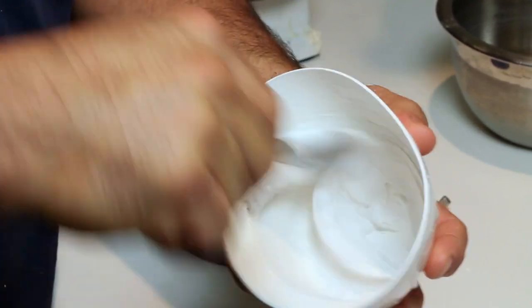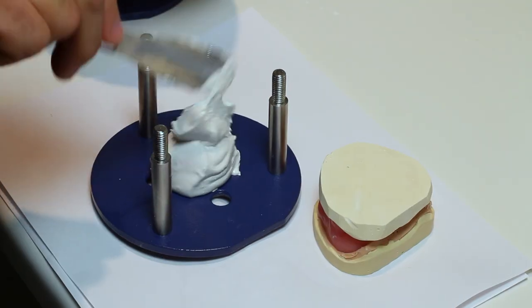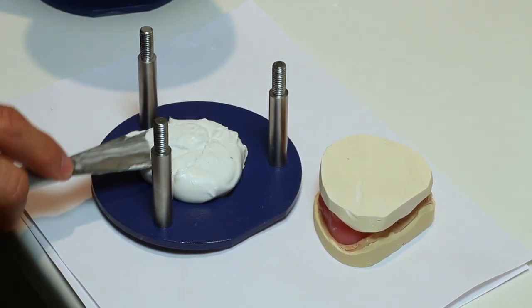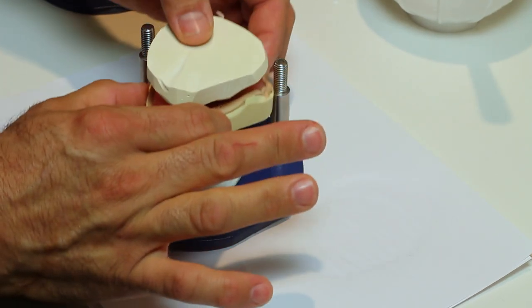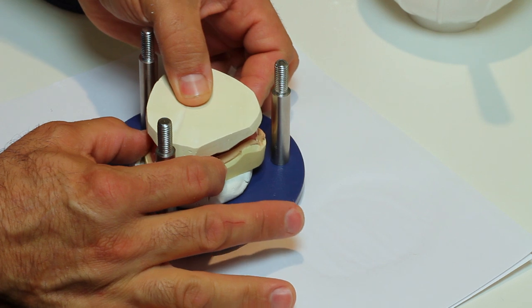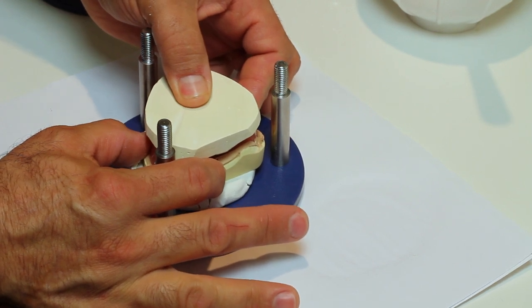Use plaster to mount the denture with poured model on the lower member of the jig. Place plaster into the hole of the lower member of the jig. Place the denture, model, and stone patty onto the plaster, teeth up, model down. Let it set.